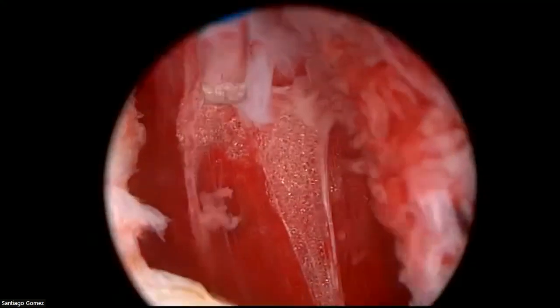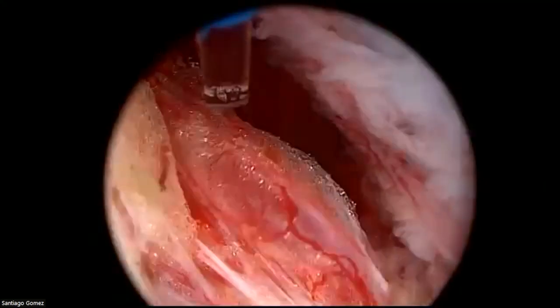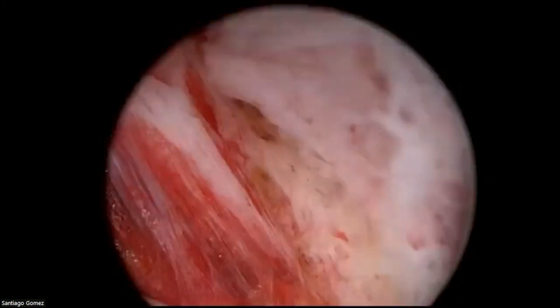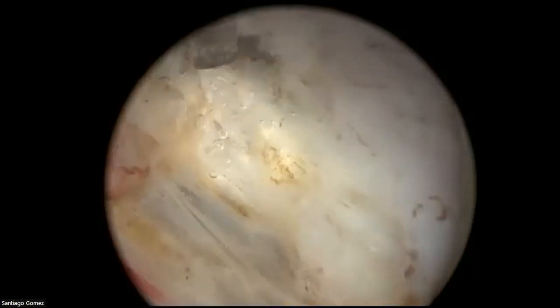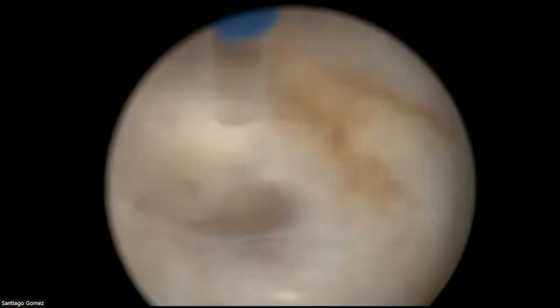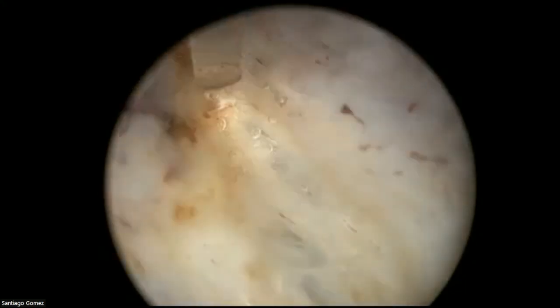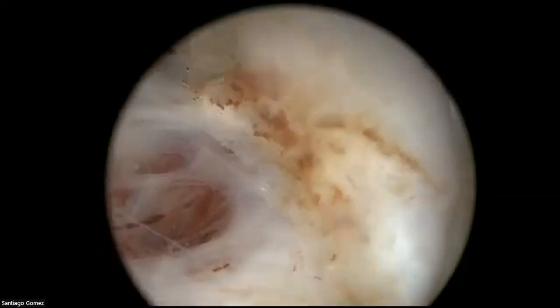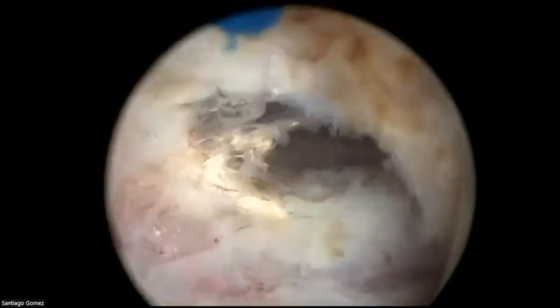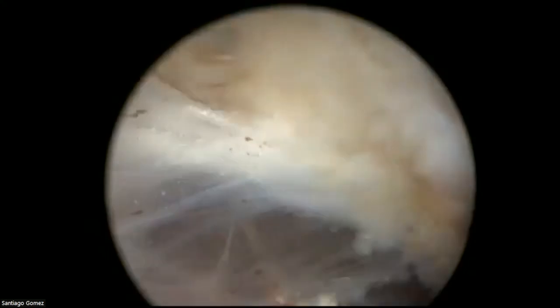So you see the approach here, I did some movement, I think, and I went slightly deep in the capsule. So let's see if I can correct here and detach this. Sometimes the prostate capsule is so thin in these areas that even with mechanical movements, if you're not very careful, you can sometimes get somewhat deep in the capsule.